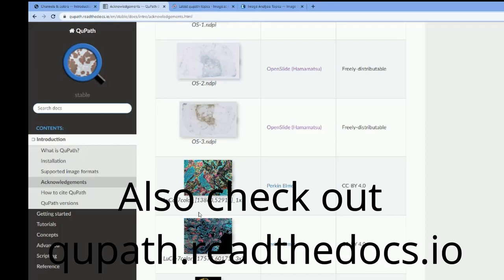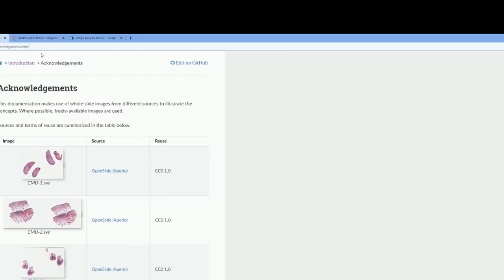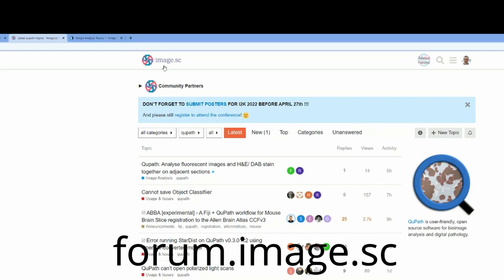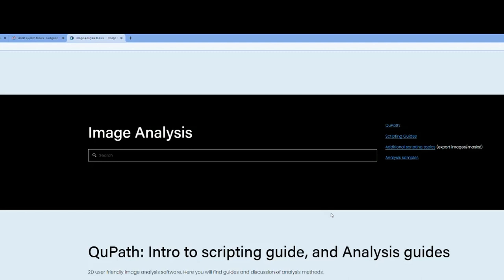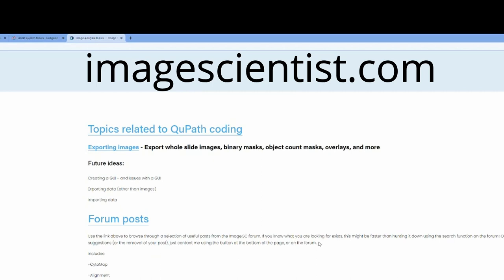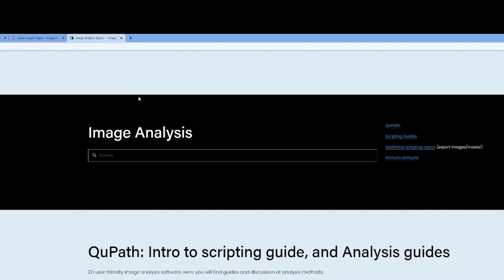We will be using some images that are available online, such as the Luca 7 color image, to demonstrate some multiplexing capability of data visualization in QPath. I also highly recommend that you visit the image.sc forum, because there is plenty of information about how to use QPath in practice. There is also a great website from Mike Nelson at imagescientist.com where you can find a lot of very helpful contributions to this project.